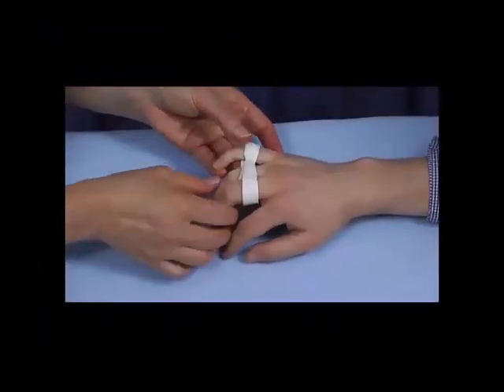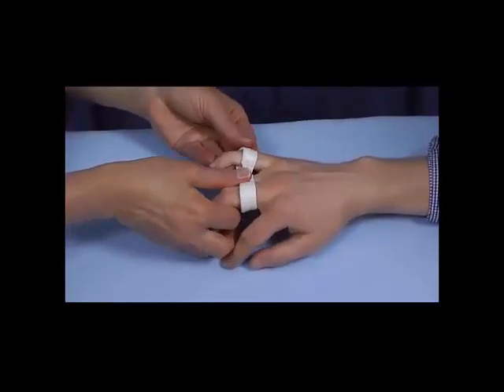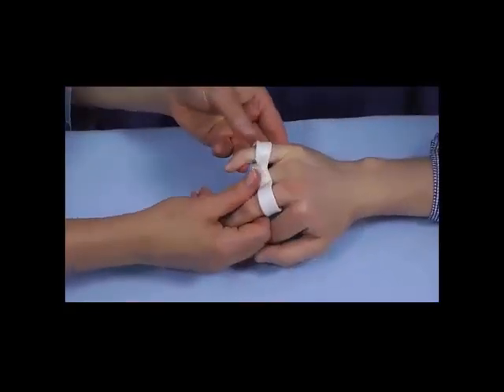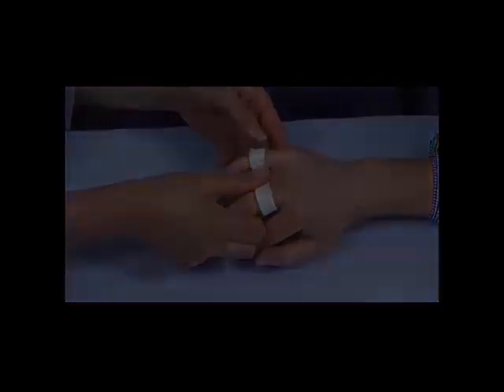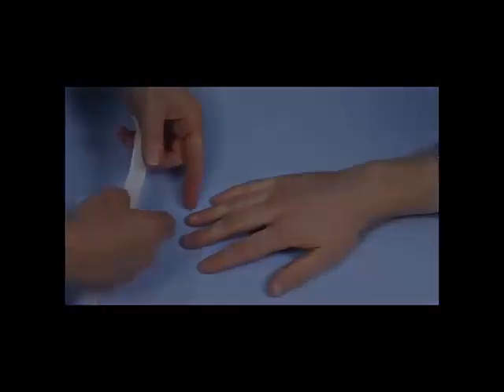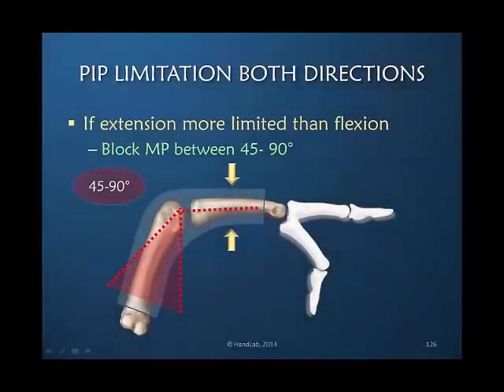I'm now going to mold it so that the ring finger MP joint is going to be relatively flexed compared to the two adjacent joints. The material has been heated, and this time we want to block the metacarpal phalangeal joint of the little finger. The patient lacks a lot of extension and only a little flexion.